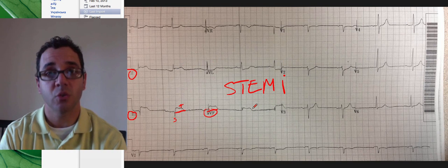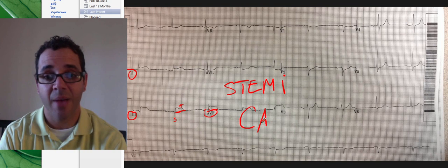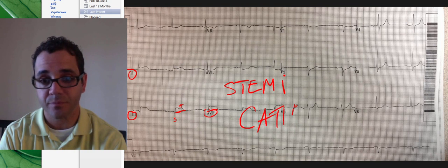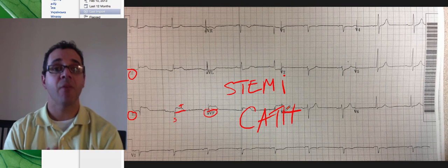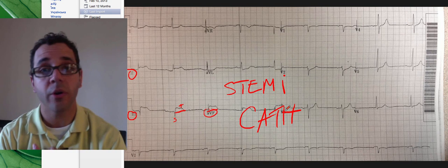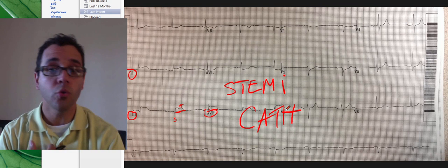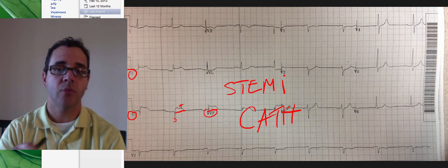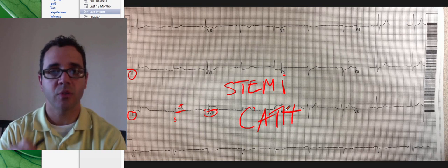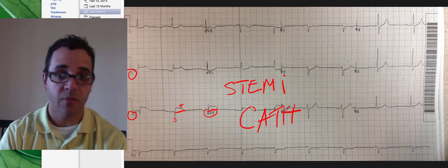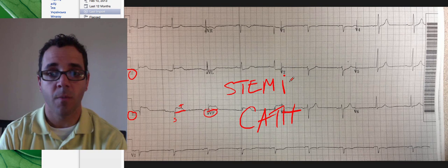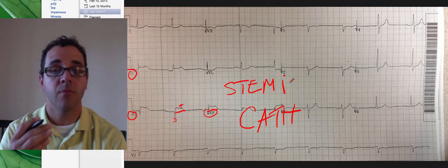This patient was taken to the cath lab where it was found that he indeed had a coronary artery occlusion, which they had to open with catheterization and stent placement, and he did very, very well.